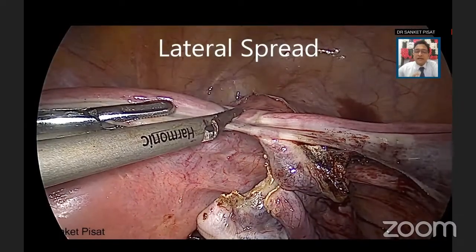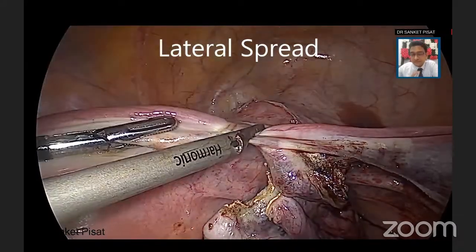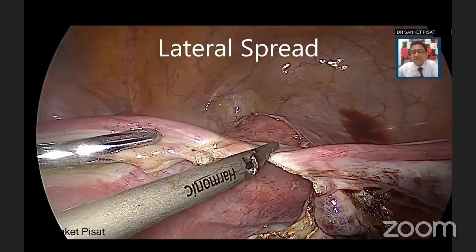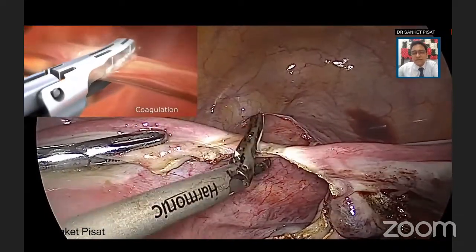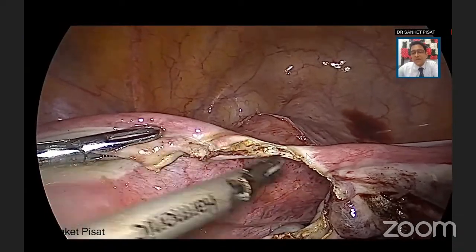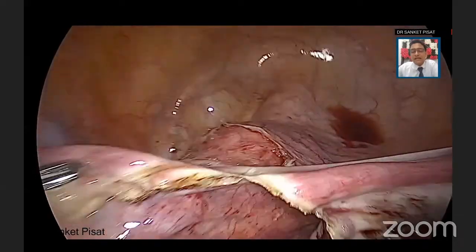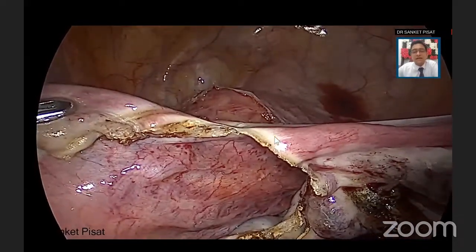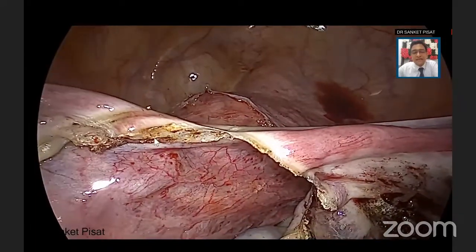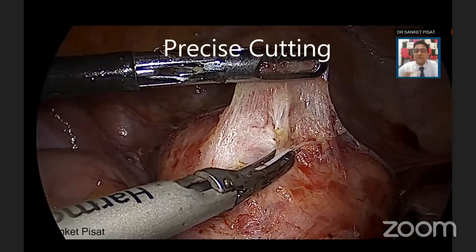Here, compare when the ultrasonic is used, the smoke generation you will find is significantly lesser. Along with the smoke generation, you find that after the cutting has happened, you can see that these are fine edges of tissue. There is very minimal lateral spread on both of these edges even after the coagulation and the cutting has been done. So this is yet another very important advantage, that there is confined lateral spread. And note the sealing of the edges as compared to the bipolar where they were not sealed, they were raw.